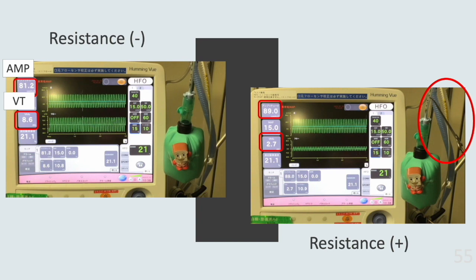He is a character that appears in the Japanese anime Anpanman. The bread man is peace-loving. You can see the bread man's swing become smaller with the balloon with the resistance attached. It can be said that tidal volume is reduced in case of pathologies associated with airway resistance.